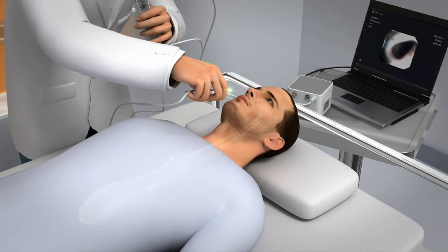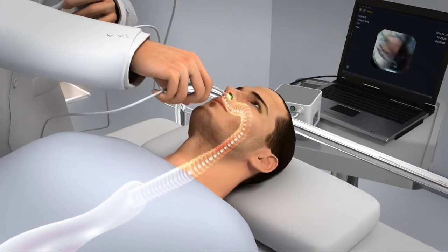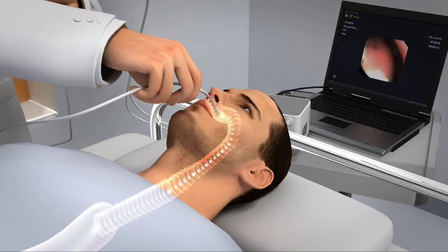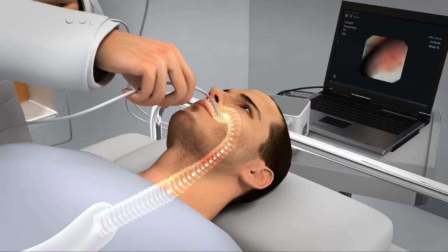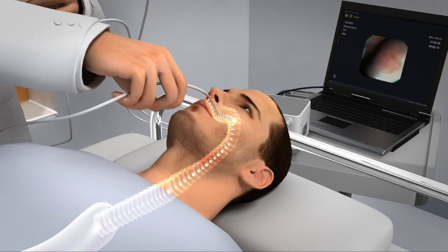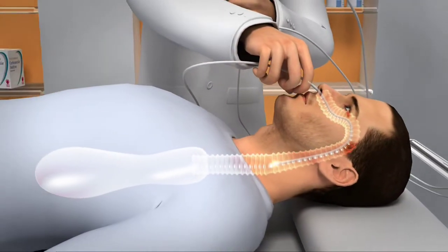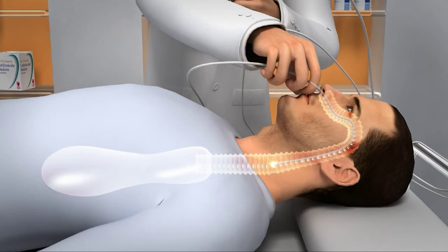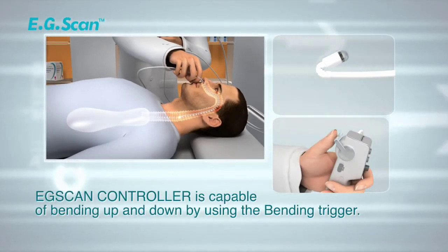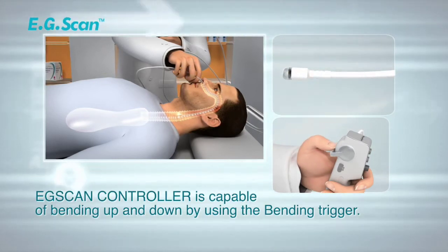Insert probe into the nasal cavity in the direction perpendicular to the face or downward to the face. Insert probe to pass through nasal vestibule, middle turbinate, and inferior turbinate. Insert the probe through lower side of the middle turbinate or to pass through the lower side of inferior turbinate and nasal septum. EG scan controller is capable of bending up and down using bending trigger.